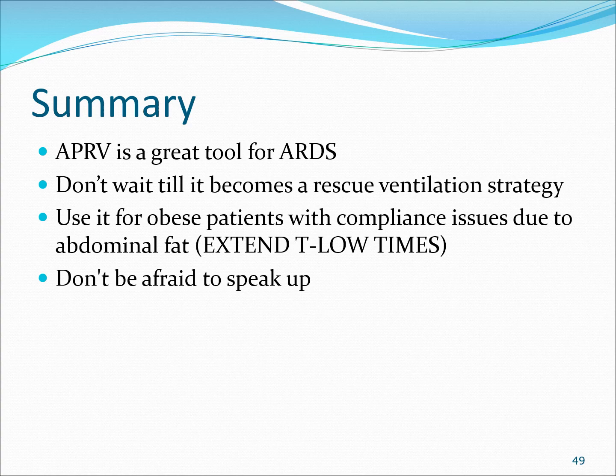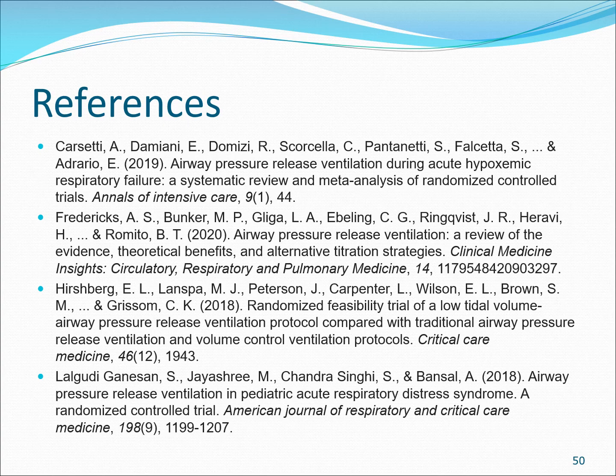If you're going to use it on an obese patient, you've got to remember they're going to have compliance issues due to abdominal fat. So what you need to do is extend the T-low times, but you need to do it prudently. So good luck with APRV. I hope you learned some more information from what I taught you. Here are some references on APRV. It's a great mode of ventilation to use, and I hope you understand it.